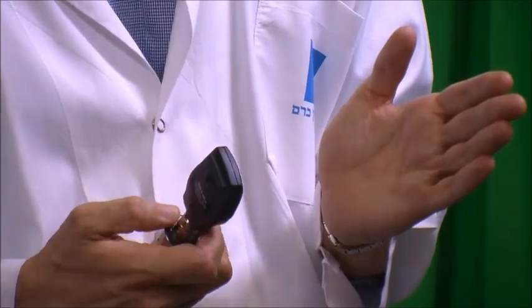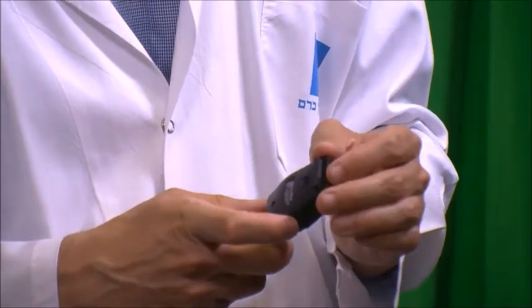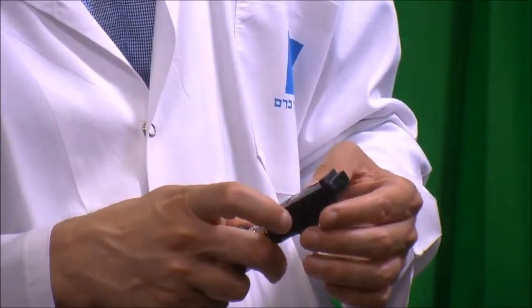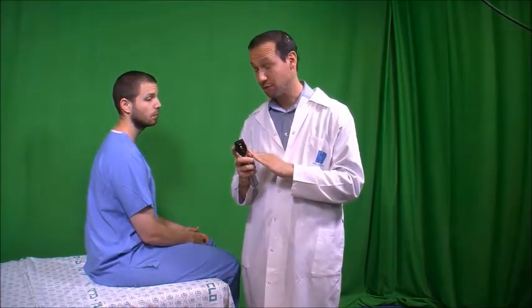On my dial here we have the focusing dial, and here I'm going to set it to a plus. There's plus and minus numbers. The plus are usually green, and I'm setting it to a high plus number of about 15. I'm holding with my right hand the direct ophthalmoscope because I'm going to examine his right eye. And everything goes together. If I'm examining his right eye, I hold it in my right hand, and I'm going to hold it to my right eye.